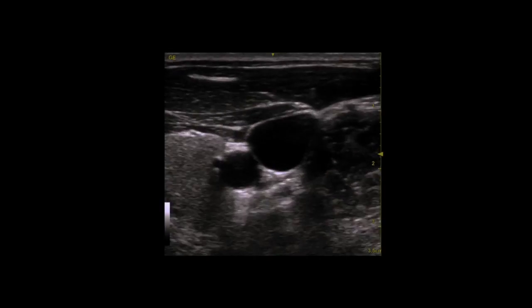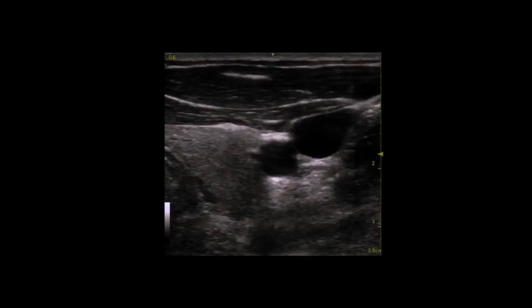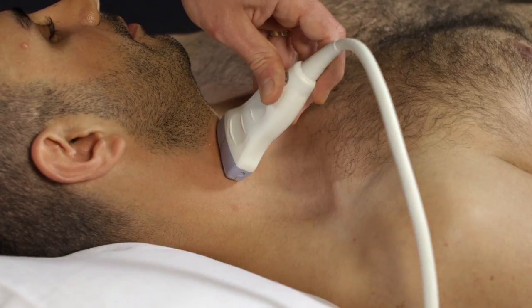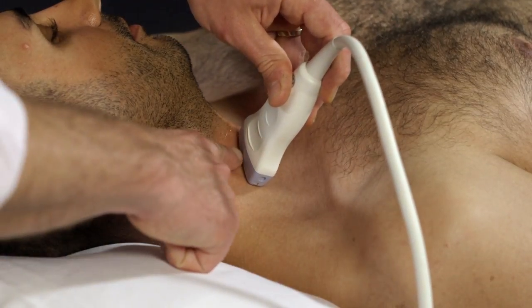Scan the vessels to find the optimal insertion site. Find an area where the vein is at its maximal size and away from an overlapping carotid artery. Mark this spot on the skin.